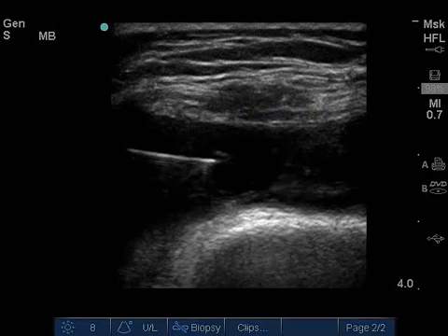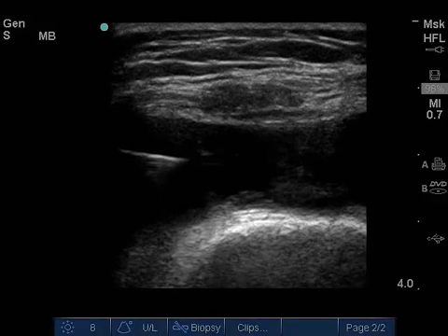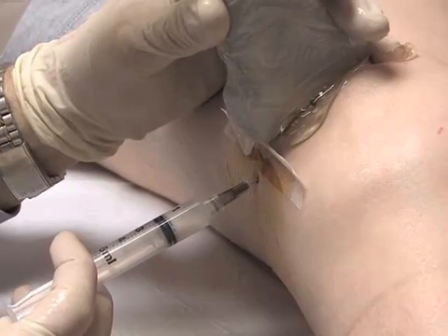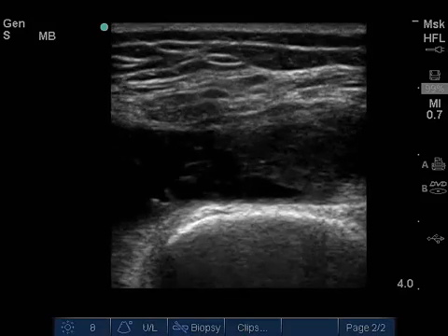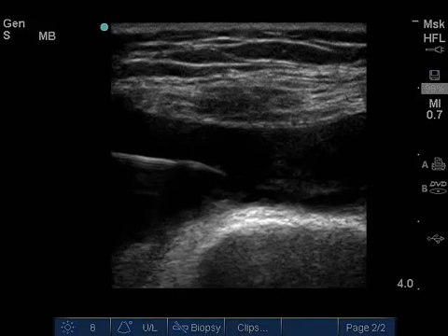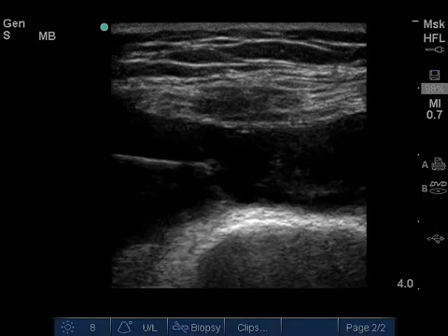Diffusion of a steroid suspension can be visualized and has a characteristic appearance of hyperechoic foci due to its crystalline structure. You perform an ultrasound-guided injection of a steroid suspension into your patient's knee. You are able to identify the effusion in the suprapatellar bursa and determine the optimal depth of needle insertion for the procedure. In real-time, the needle is visualized as it enters the bursa and the steroid suspension is seen as it flows in.